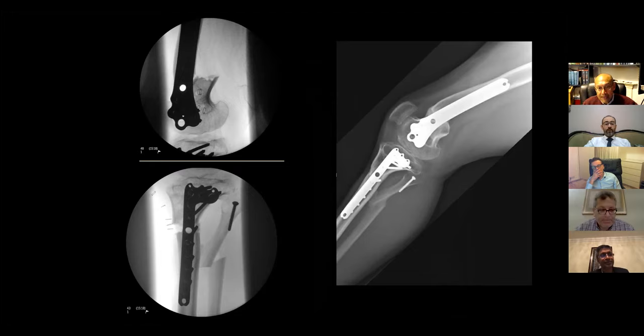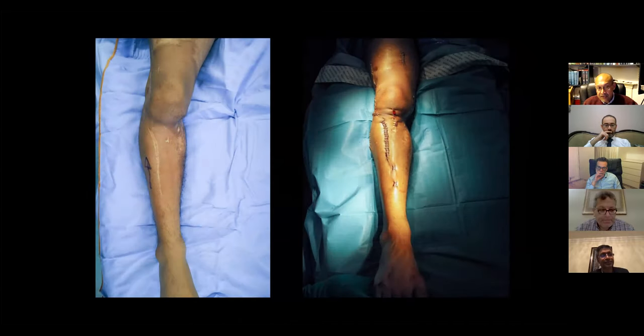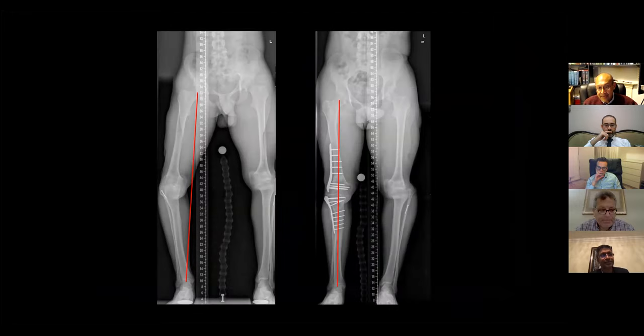What about the clinical appearance? Because this is an acute correction, this is something you can see immediately in surgery. You can see that the translation has been corrected intraoperatively, after closure of the wounds. And here we have that varus deformity in the AP that is improved and confirmed by standing x-rays taken after surgery.